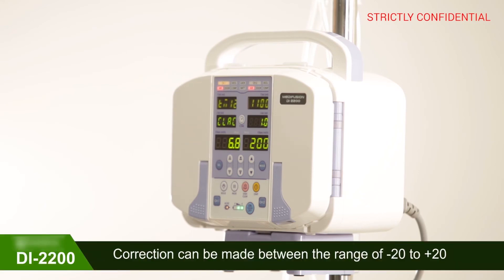To correct for any plus value, use the UP key to adjust the value. Likewise, to correct for any minus value, use the DOWN key to adjust the value. After input, use the BOLUS key to complete the setup.